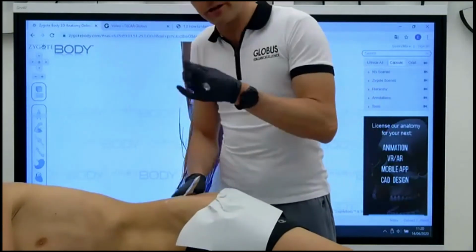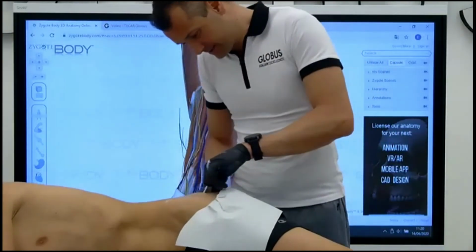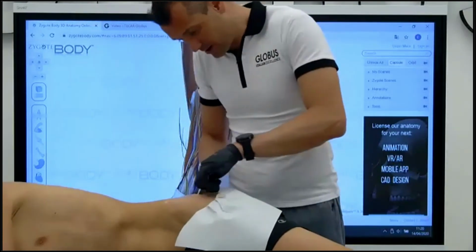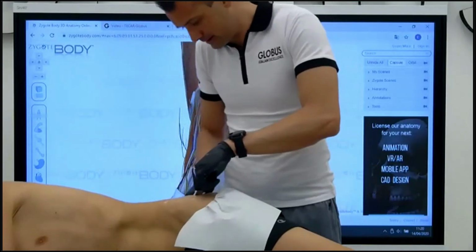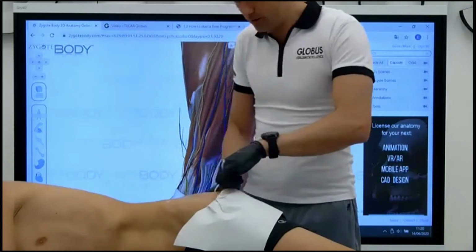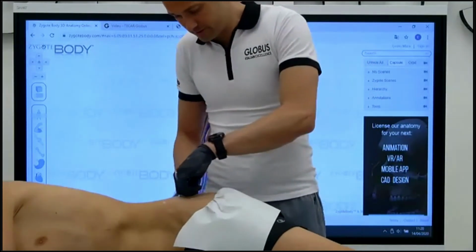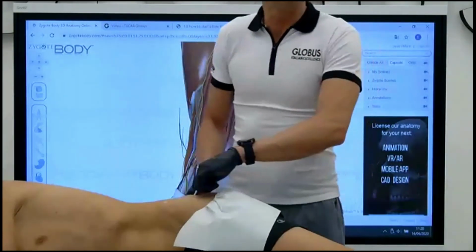I can also feel a noise under here. It is the noise of the densification of the fascia that we are going to loosen, that we are going to resolve. From zero to ten, how warm do you feel? 6. We are always around 6, 7 in terms of perception of temperature. Can I ask you for the thermometer, please?